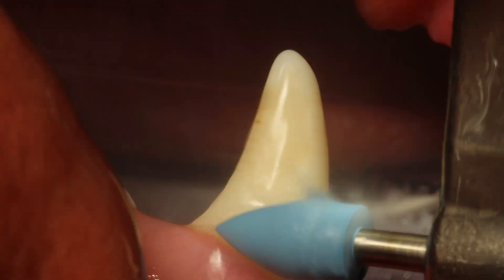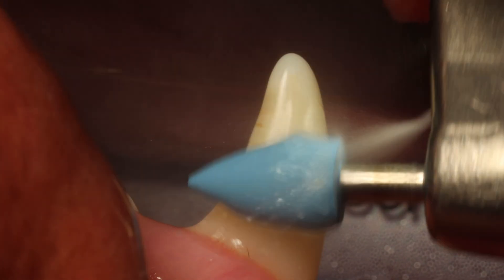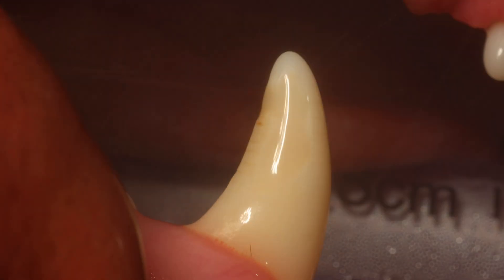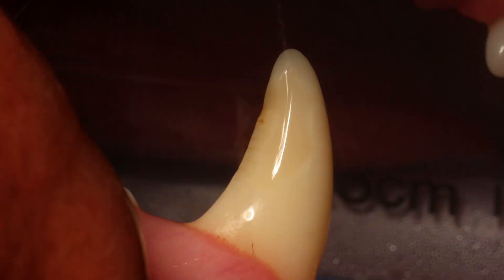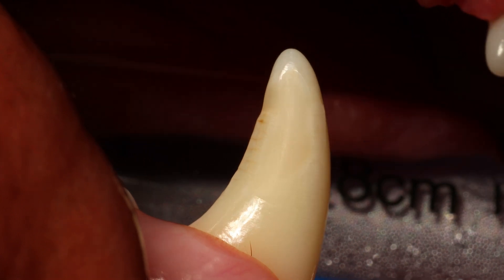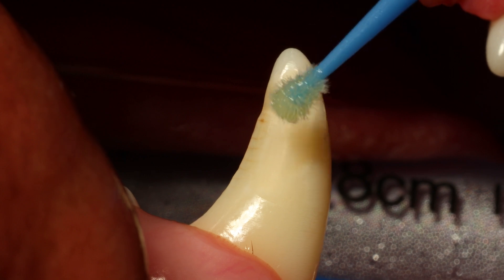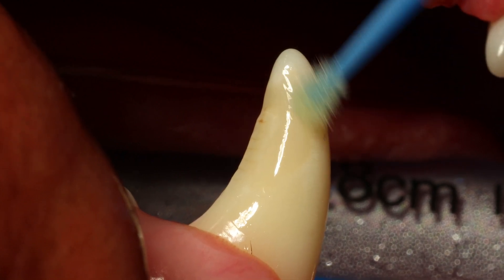Now I move up to even softer polishing — this is like a profi cup or polishing bur — just for the final smoothing of that surface. Then you air dry it again, making sure there is absolutely no moisture, and then you apply a final layer of the bonding material.